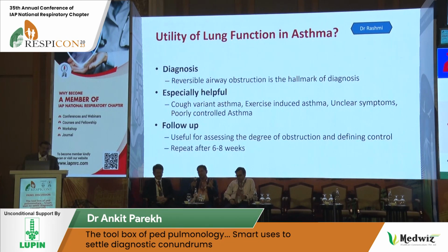Second, follow-up. Suppose you have started treatment as we discussed. In between, spirometry is still abnormal. So you have to revise the treatment plan, checking whether the compliance is fine or not. If compliance is good and lung function is still poor, you have to escalate your therapy.